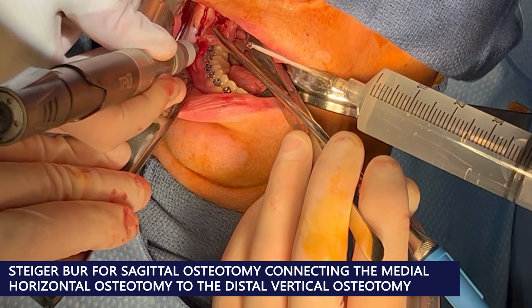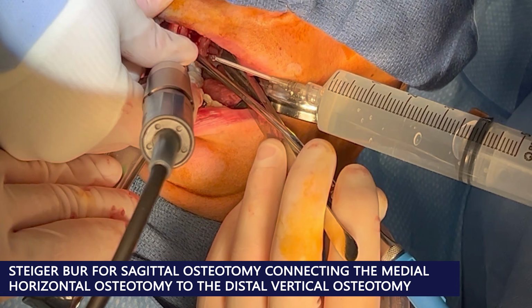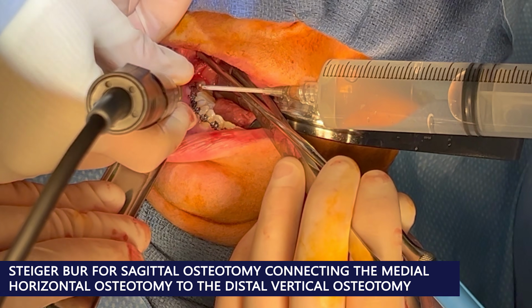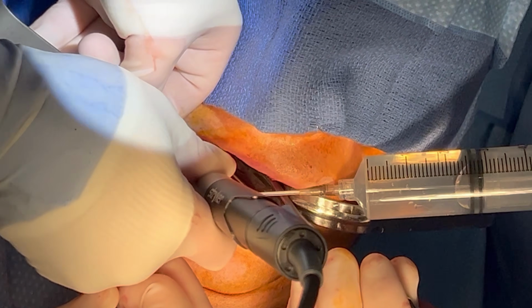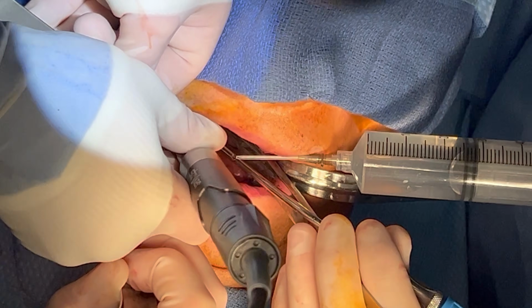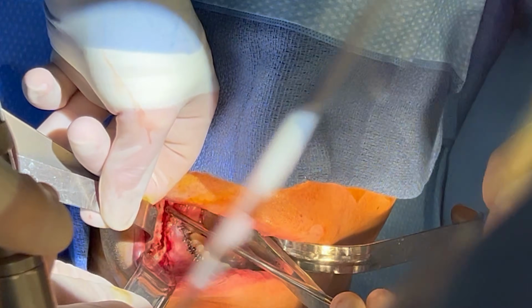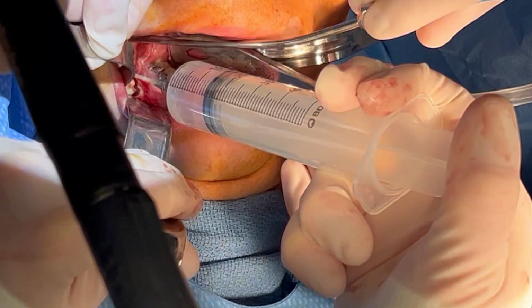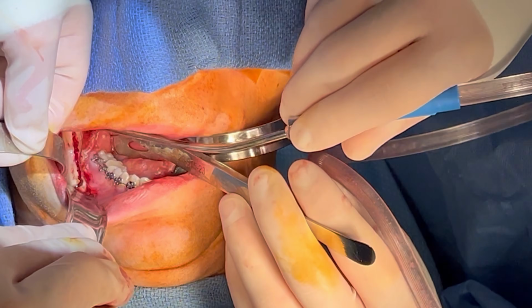I then use a Steiger burr along the lateral cortex, extending from the medial cut above the lingula down to the vertical cut along the buccal aspect of the mandible at the first molar. It is important to confirm the buccal cut is carried all the way to the inferior border of the mandible and completely through the cortex.